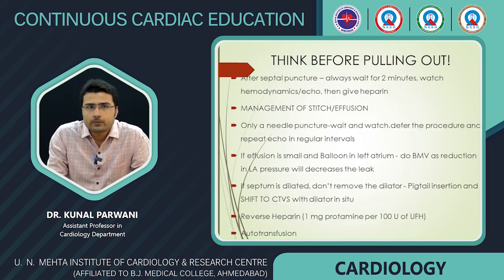Think before pulling out. After the septal puncture, always wait for 2 minutes. Watch hemodynamics, watch for echo, and then give the heparin. Management of the stitch or effusion we have already discussed. If only a needle puncture is made, then you can defer the procedure, wait and watch, and repeat echo at regular intervals.